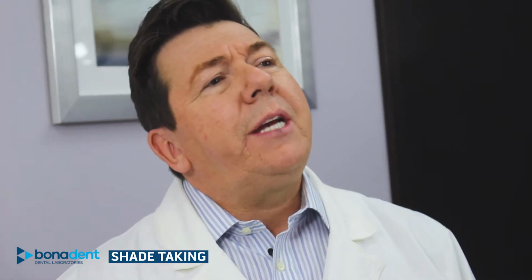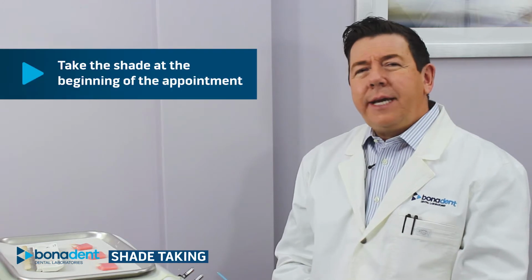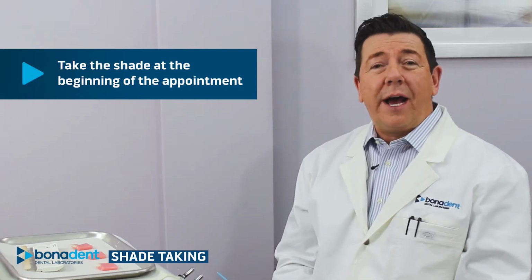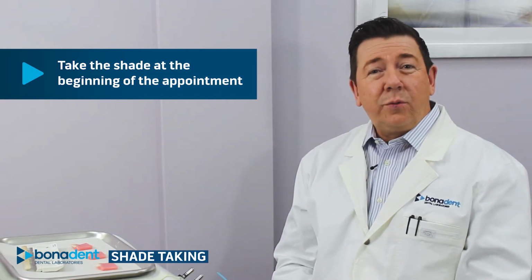Today's subject, shade communication. I think we'd all agree that shade communication is one of the most important aspects of a beautiful aesthetic result. The first thing you want to make sure is that you take the shade at the beginning of the appointment. You don't want to take it after the prep or the impressions. You want to take it while the mouth is still fully hydrated and the color is full. So when you first get into the appointment, take those pictures.